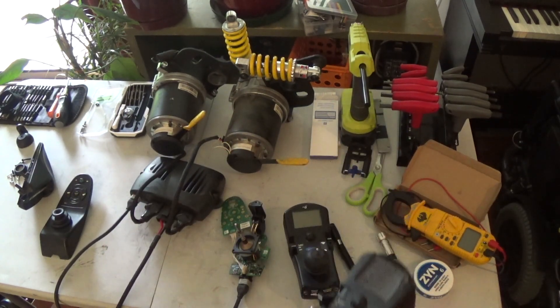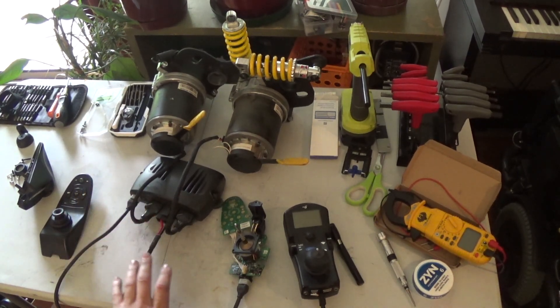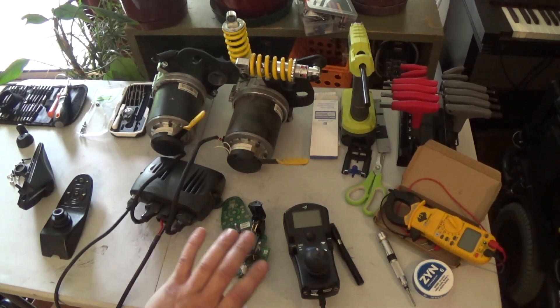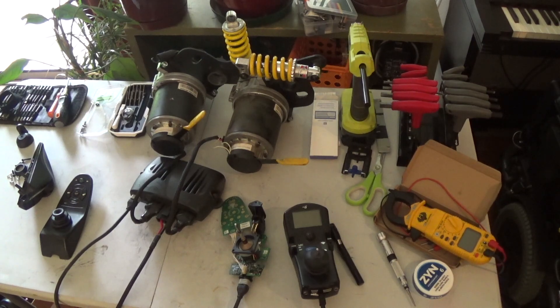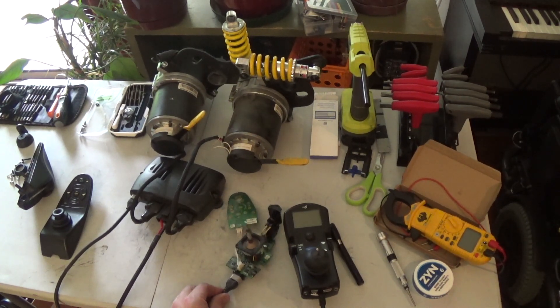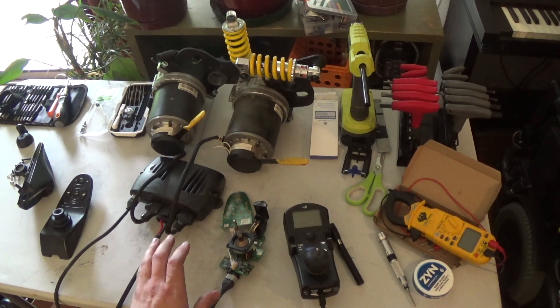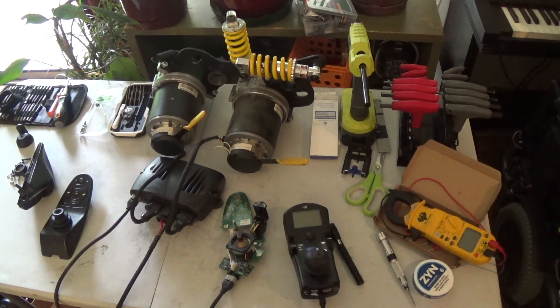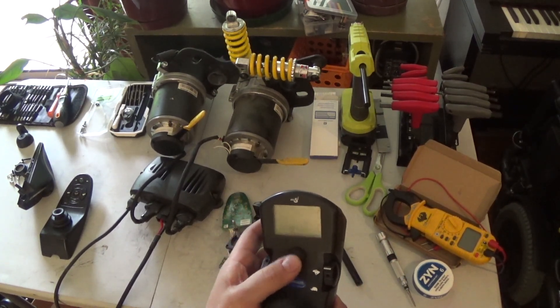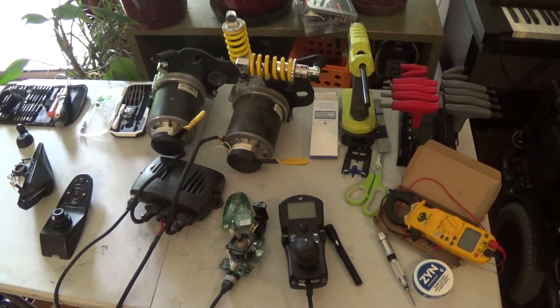Conclusions: if you've got a regular Invacare MK6 controller set up for just drive with no accessories or power seating, it looks like it will work fine with the MK5 Shark joystick. If you have seating accessories or other things it's expecting to see, you can bypass it with the color MK6 joystick, but the grayscale one will not allow you to do a reset input to bypass those errors.